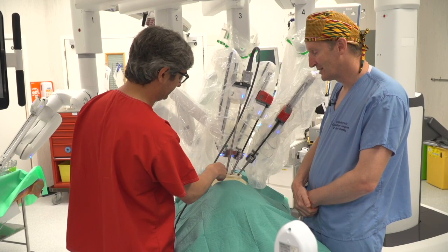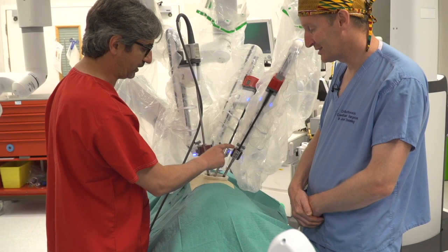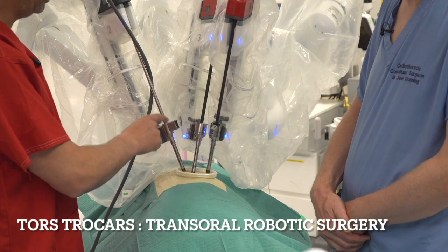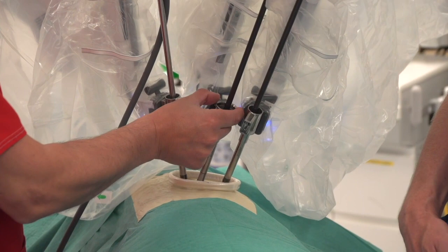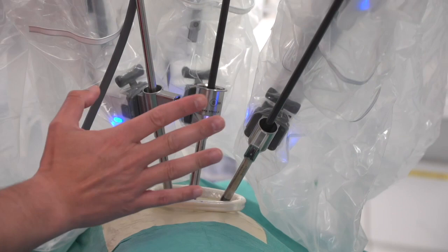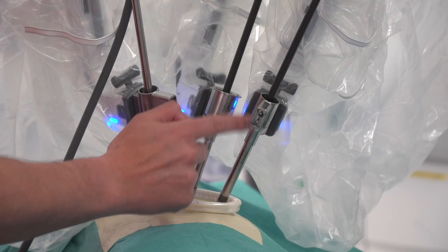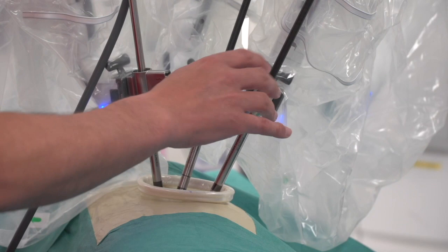Another important thing is that you see there's no collision normally. The only thing is that now we have changed, because we have seen that with the trocars that the ENT surgeons use, called TORS trocars, transoral robotic surgery trocars, we have more space because this diameter is bigger. So we avoid the collision in between. We use two of these trocars and one normal trocar in the center. If you hand customize the trocars and remove this piece, you can use three trocars, and that will be perfect. We are waiting for Intuitive to create these trocars without this piece, because this piece is only for transoral surgery. We don't need it at all in thoracic, so we can remove this piece.